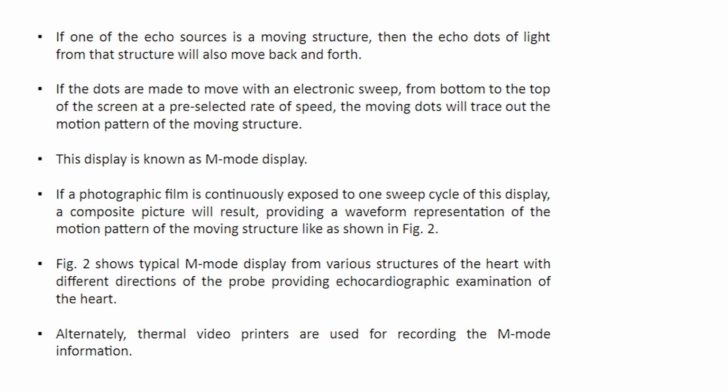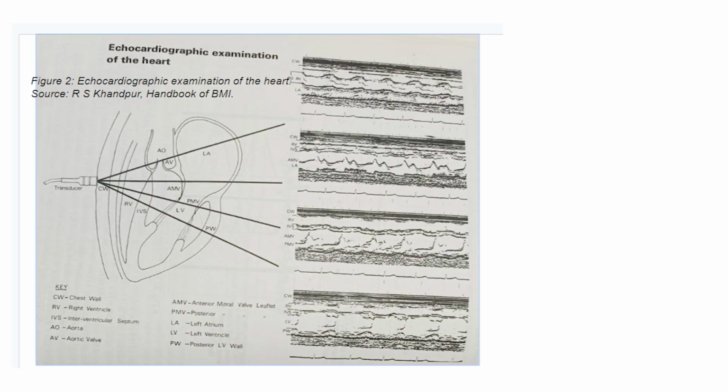Alternately, thermal video printers are used for recording the M mode information.